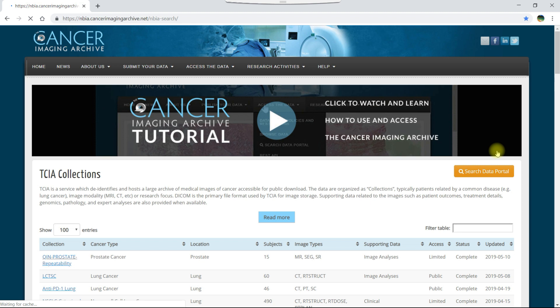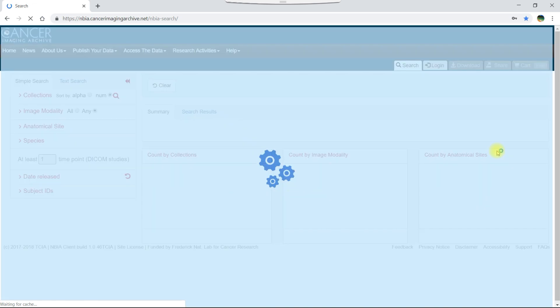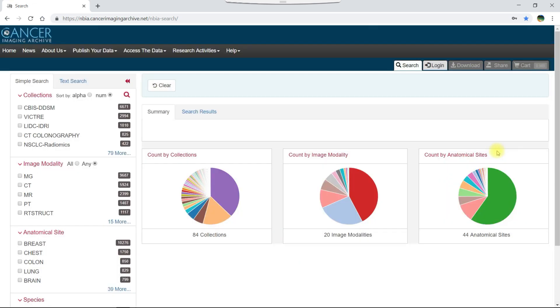Before we can download data, we have to search for it and add it to our cart. To add data to your cart, you simply select it.